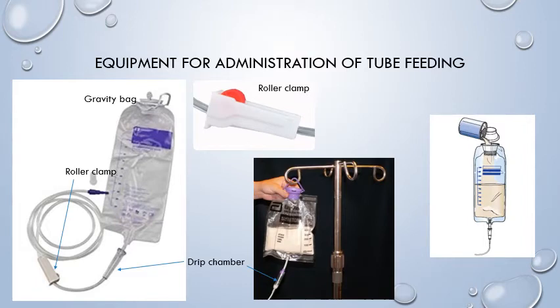If a person uses a gravity bag, the person has demonstrated that they do not tolerate a bolus feeding. During a bolus feeding, they're given a large amount of liquid in a short amount of time. A gravity bag is used to slow the rate of the tube feeding down. There will be a drip chamber for observing how fast the supplement and water are running into the tube.